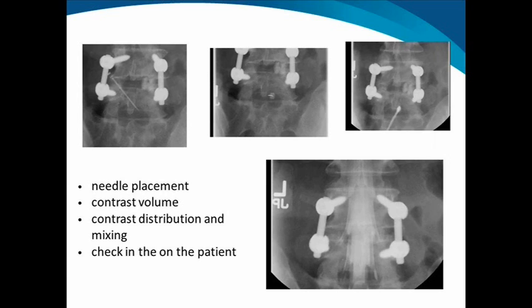Here's an example of a myelogram performed at the L5-S1 level, below the level of a stenosis, below the level of a fusion performed at L4-5 for evaluation of proximal level stenosis at L3-4, the adjacent level. In the first image, you can see a marker needle placed with the tip overlying the intended site of puncture. The second image in the center shows a needle directed along the line of sight of the X-ray beam in a left paramedian, right, patient is prone, right paramedian sublaminar approach.